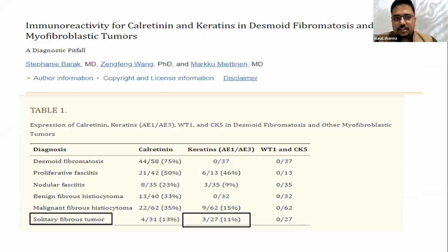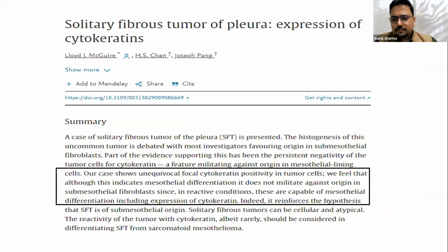Why did you not think of synovial sarcoma when CK was positive? Synovial sarcoma, we did not think of it primarily because of CK positivity of this extent, plus the morphology was not very typical. These cells were looking very epithelioid to me. But epithelioid synovial sarcomas are also there. And thankfully, much before I had to put my BCL2s and TLE1s, I did come up with my diagnosis.